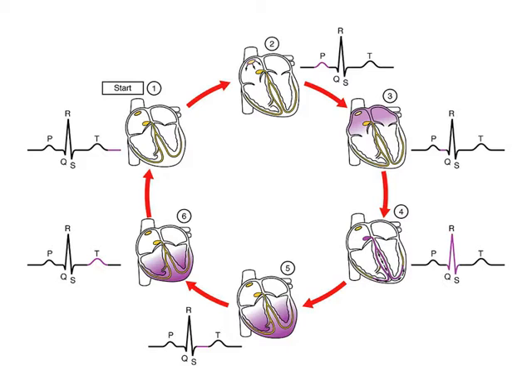of the ECG trace. So every cardiac cycle starts with some spontaneous depolarization, and normally, where does that start? Sinoatrial node, absolutely. SA node way up here on the left, highlighted, will initiate the depolarization that spreads across the atria. The signal itself corresponds with the P wave, and then as the signal spreads, the contraction and refractory period overlaps with the break between depolarization of the atria and the ventricles. So the signal to contract is what we register on the ECG, and the contraction itself occurs between signals, if you will, during the PQ or the PR interval.